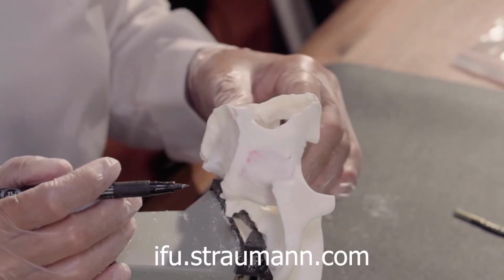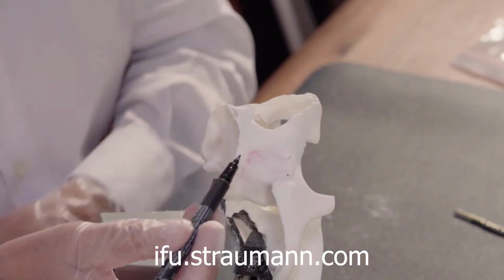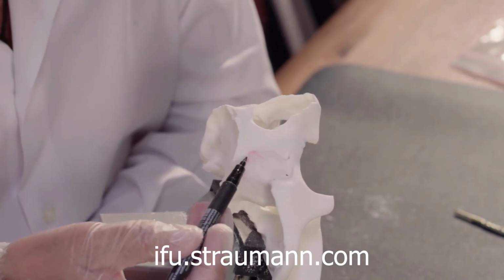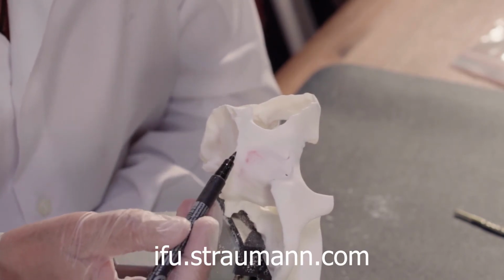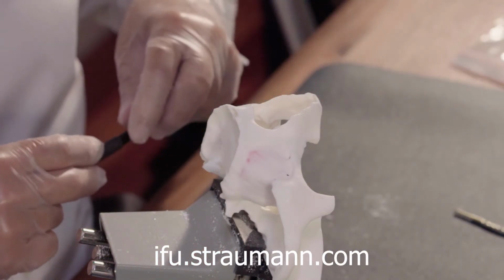So you remember this patient model, 3D model, is much more atrophied on its left side, and this is the side we are going to work on now. So you probably can see transparency of the sinus, so this means it's very, very resorbed. We are forced to take an extra-sinusal path because the amount of bone we are going to perforate here is less than 3 millimeters.